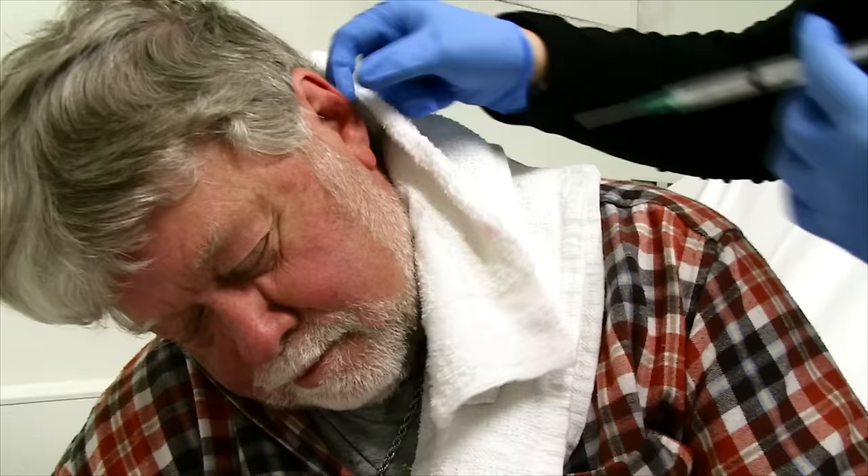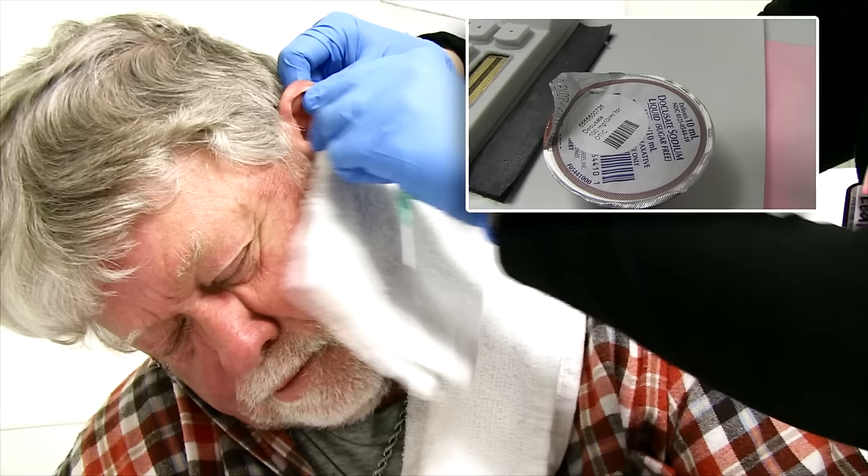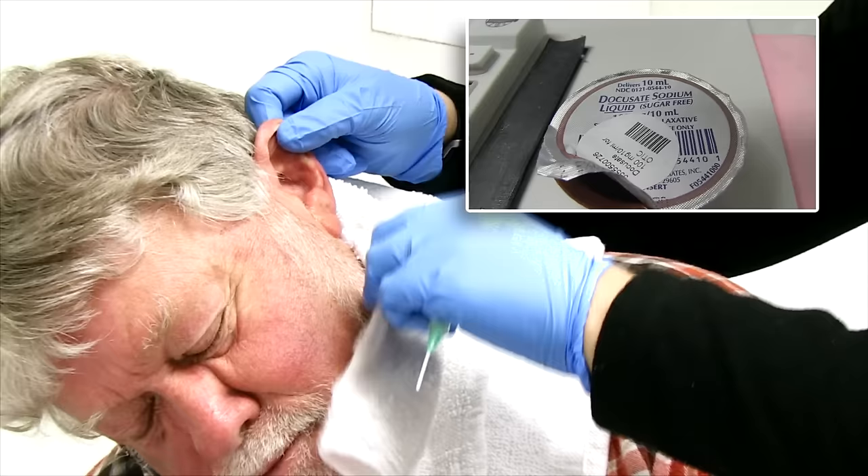You have to repeat that cycle sometimes. I was thinking you were taking a capsule and breaking it up, but we actually have the liquid Colace.